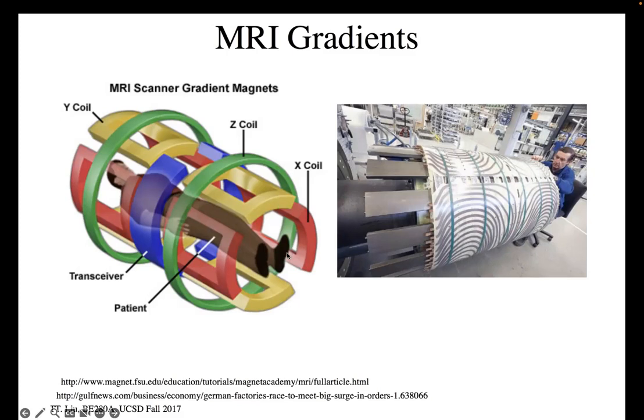Okay, so the next set of coils we're going to become acquainted with are called gradient coils. What these do is produce a change in the static magnetic field. Remember, the static magnetic field from the windings in the big coil goes along the bore of the scanner. We put the patient in there and they are bathed in this very strong magnetic field. If you don't do anything, they're just sitting there in this large field, and you generate a magnetization in the patient.